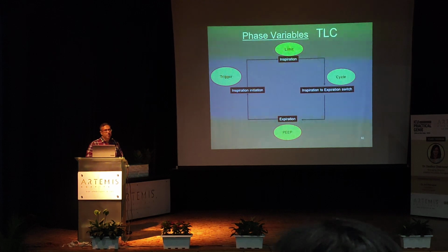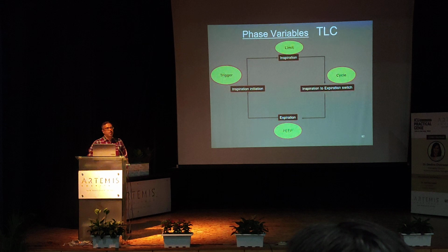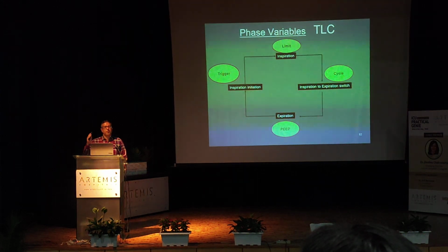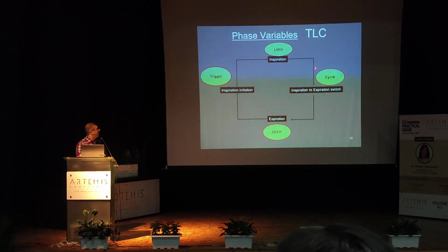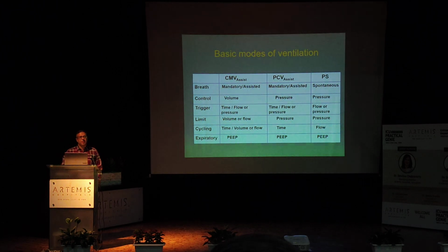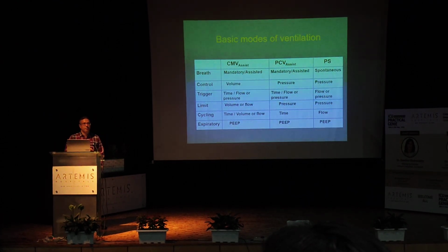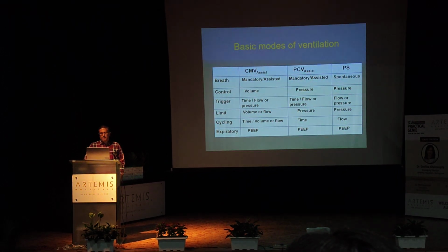I will be just covering this briefly because it's a complete mechanical ventilation class. So this is all you need to know about the ventilators. The trigger which initiates the inspiration, the limit of the inspiration, and how you cycle from inspiration to expiration, and then the peep. So these three are the inspiratory ones and this is the expiratory one. And based on this, you classify the basic modes of ventilation. You want me to cover this? Yes. Or you all know this? Cover this.